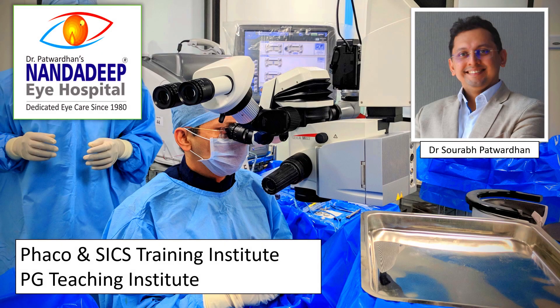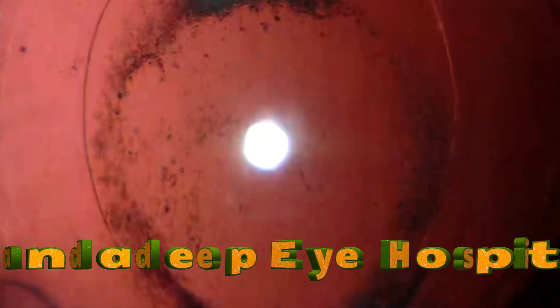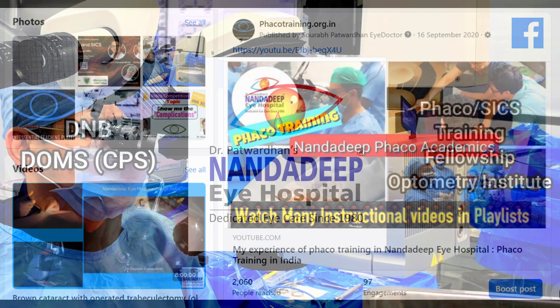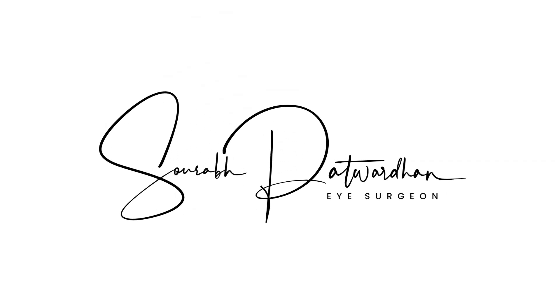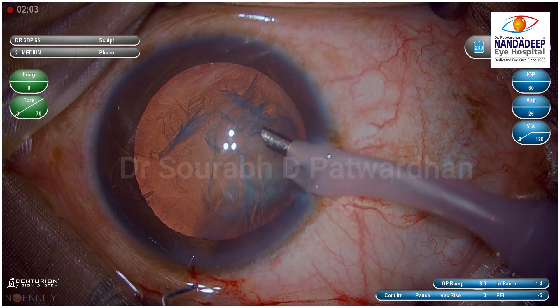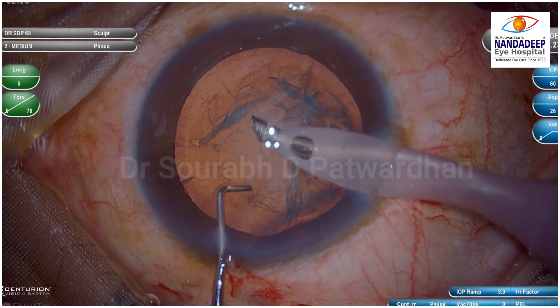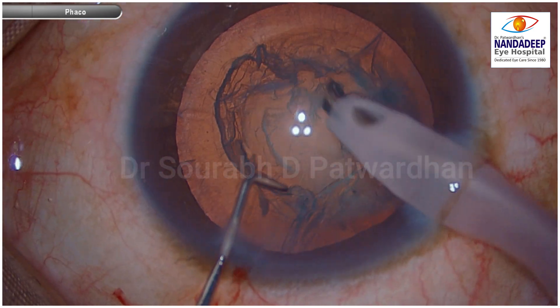In this new video series, I call it the pattern recognition series, I'll be going through some video clips where I describe certain patterns which will help you while learning. These are the patterns which, when you recognize them, you understand what the consequences are going to be. In this video, I am describing a sign I call the cigar sign, which will help you with pattern recognition while doing trenching in a case of cataract.